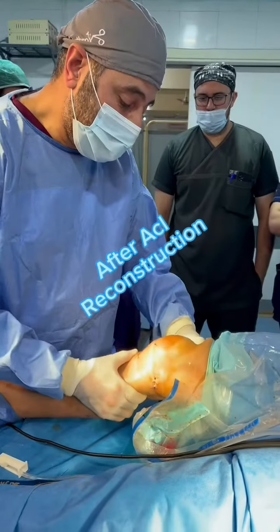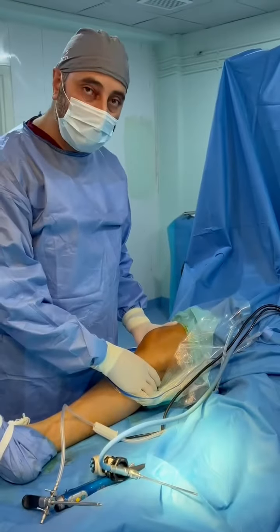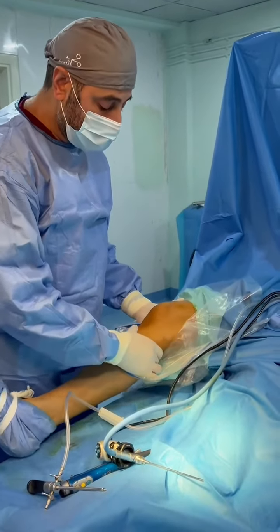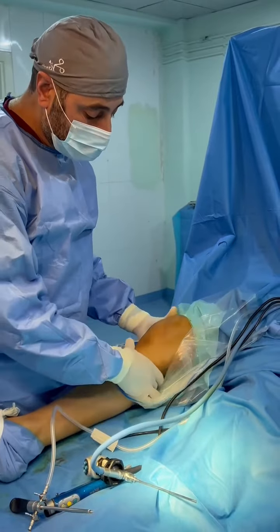Stability is restored and Lachman is negative now. The knee is stabilized. This is a right side ACL injury. You can see the right knee is unstable. This is a Lachman positive test. Lachman positive test. Okay.